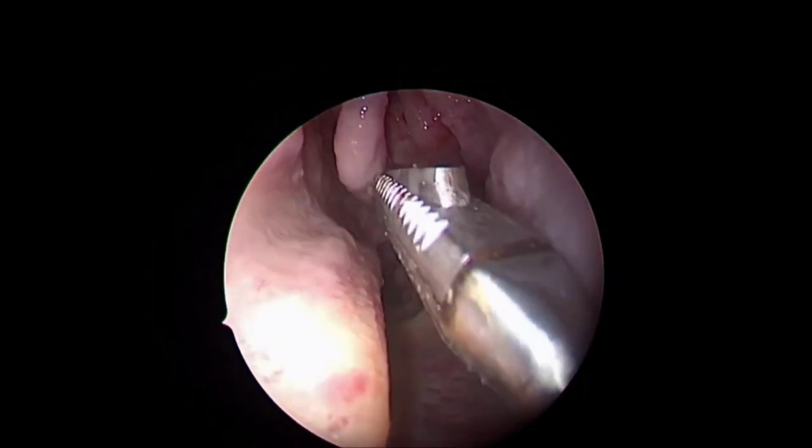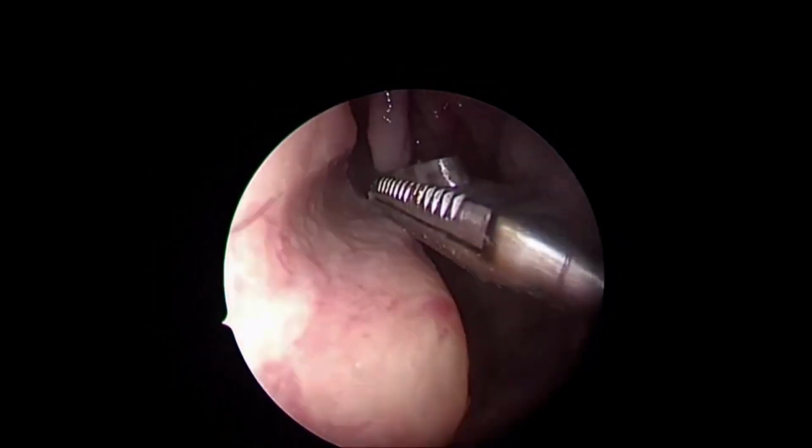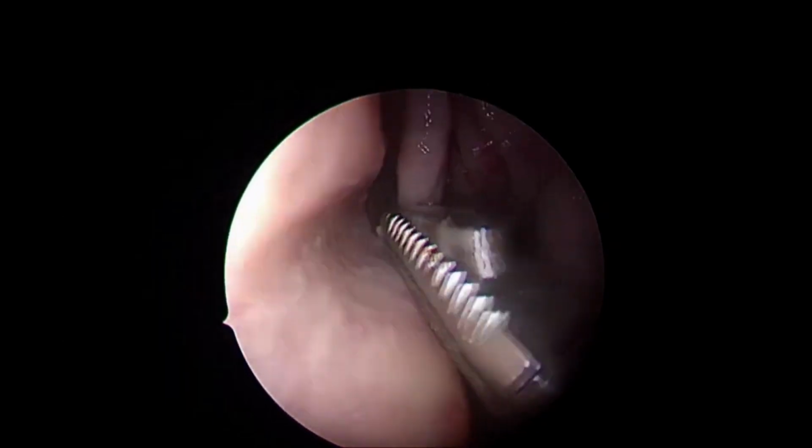You want to show through the external camera? Yes, sir. Many are requesting you to. Can you put a PIP?